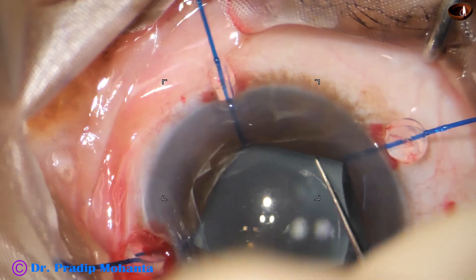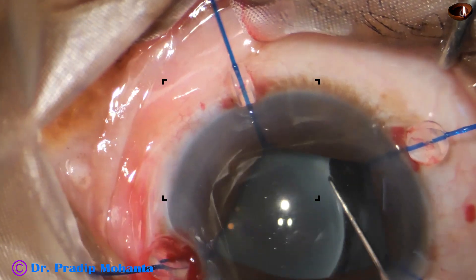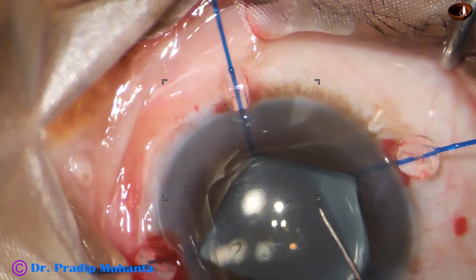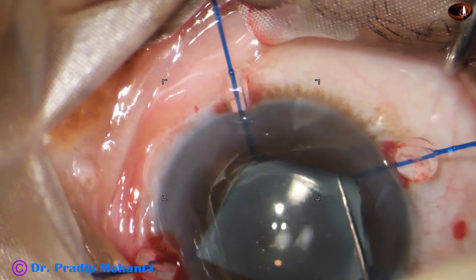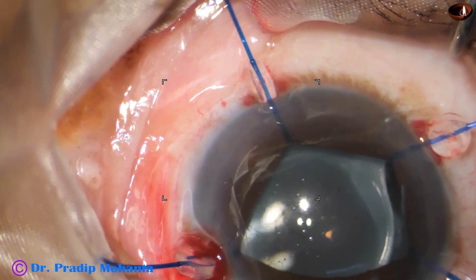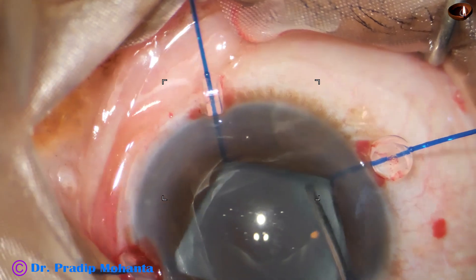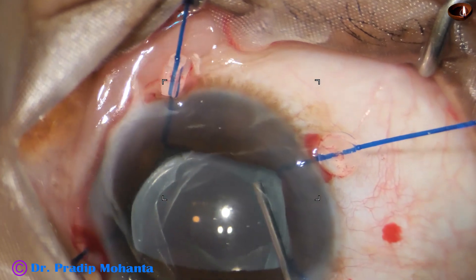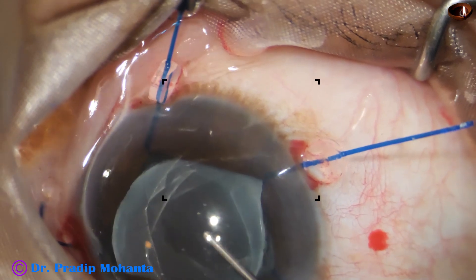We can see the rhexis margin now and the IOL is in the bag. Now I try to mobilize the lens. I should inject some visco underneath the rhexis margin, so I am doing that.